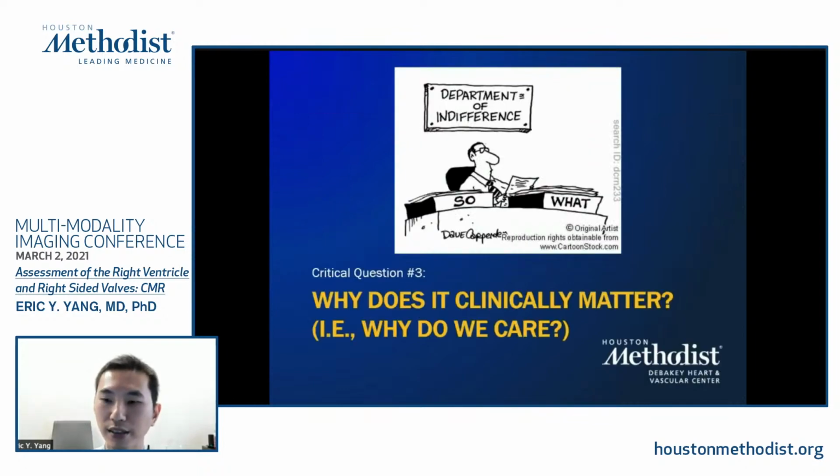So does it clinically matter? And that's always a good question. Dr. Quinones is a so what kind of question. And for that, I hope to take you through some basic prognostic information, and take you through some different cases, showing some use case scenarios.